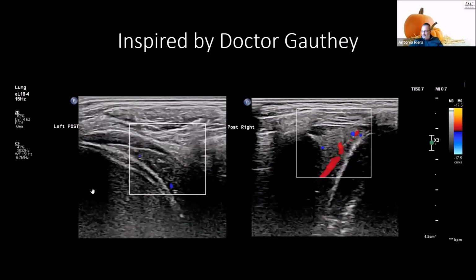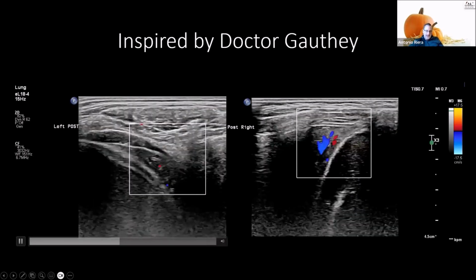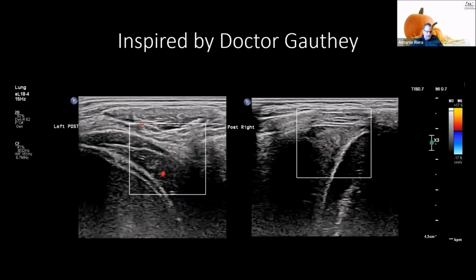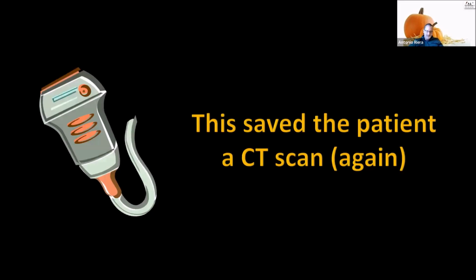So we did this at both bases, on the right side, left side. You can see these changes here, even with the patient breathing. And I didn't do a CAT scan, and I treated this child for atypical pneumonia, just based on the age and the bilateral findings. And he did fine. Did not call the surgeons, did not do a CAT scan. And this one I couldn't call because of the language barrier, but I've looked at the medical record multiple times, and no visits to our hospital or our referring hospitals where he came from to us.